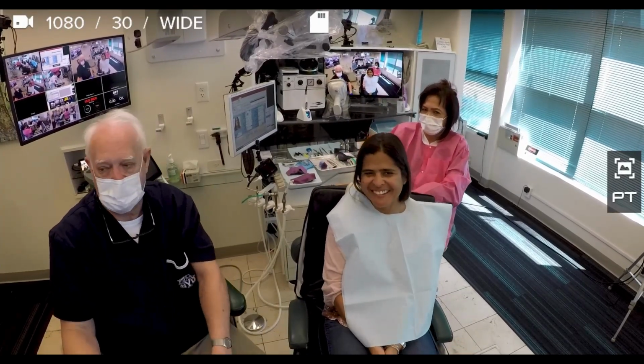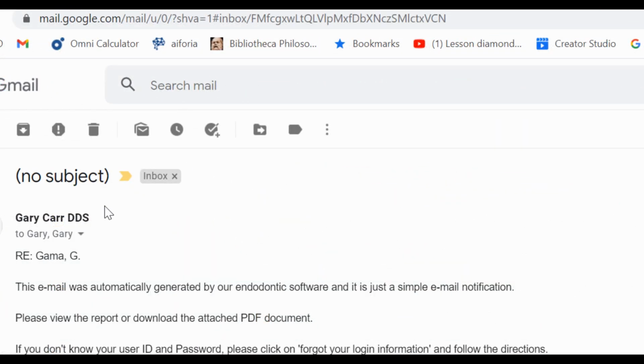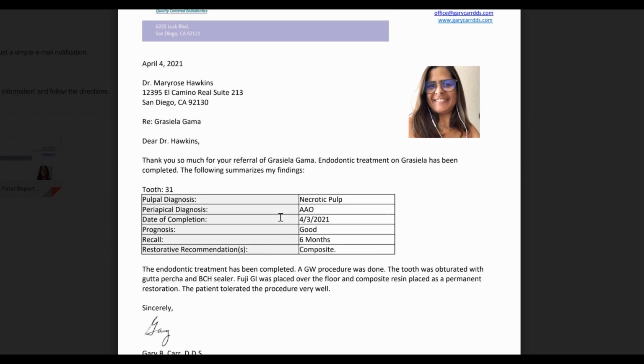Thank you. Okay. The referral doctor selects the email, presses on the link, and immediately reads the report before the patient has even left your office.